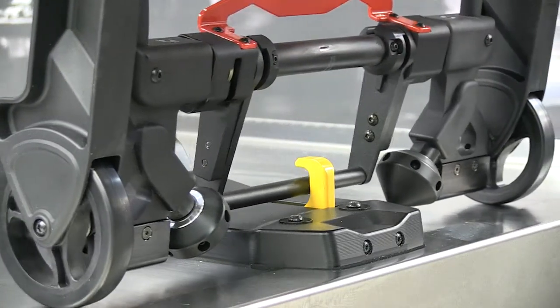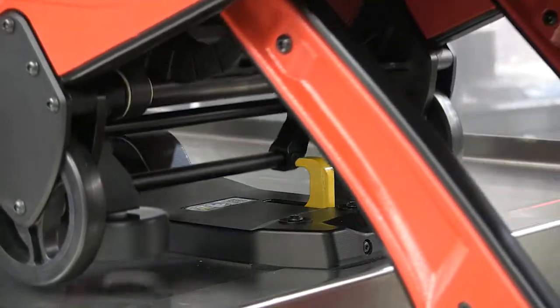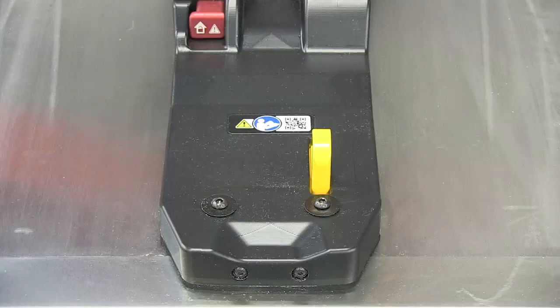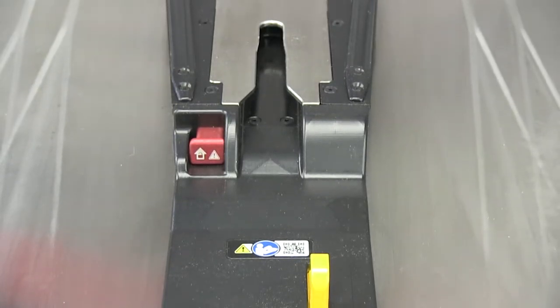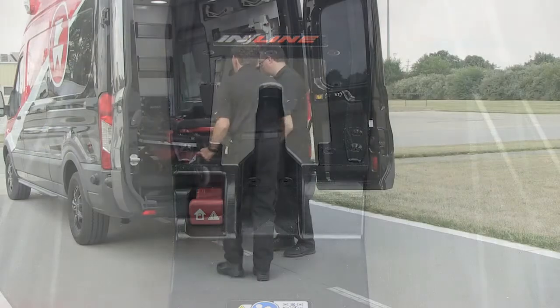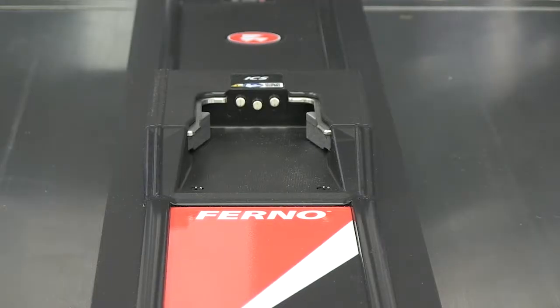During both the loading and unloading process, the safety hook holds the compatible FERNO product securely inside the vehicle while the operators raise and lower the undercarriage legs. The fastening post retainer is located on the nose of the fastening system and captures the control end post of the compatible FERNO product and helps hold it in the fastening system during vehicle transport.